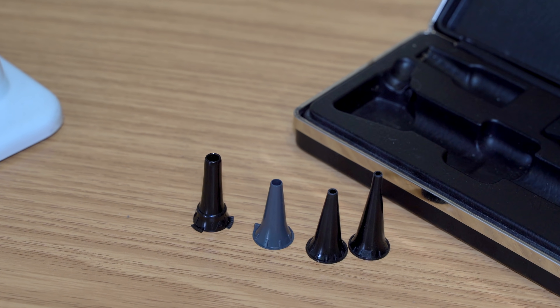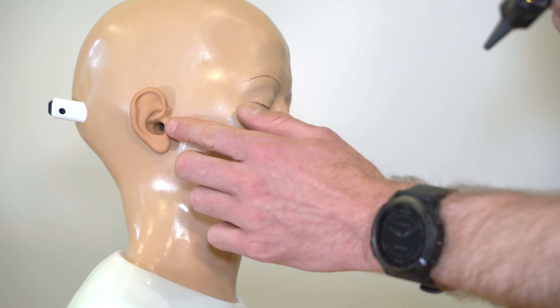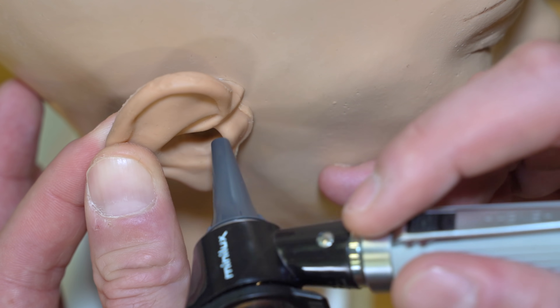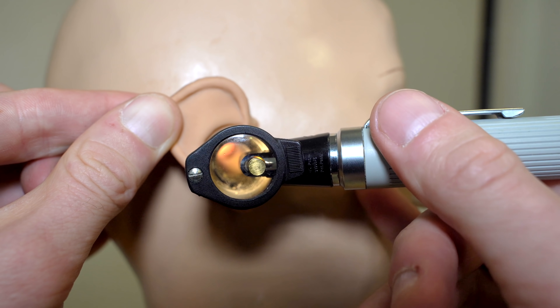In terms of the examination, we take our otoscope and use the right hand to examine the patient's right ear, holding the ear back with the left hand, and use the left hand to examine the left ear, pulling the pinna back with the right. We need to select the correct size speculum — a large speculum for adults through to very small speculae for children. We observe the ear for position, scarring, and bruising, then press over the tragus and pull down on the pinna to check for pain. We pull back the pinna before inserting the speculum, resting a finger on the patient's cheek to avoid accidentally banging them, then move the speculum to get a good view of the canal and tympanic membrane.